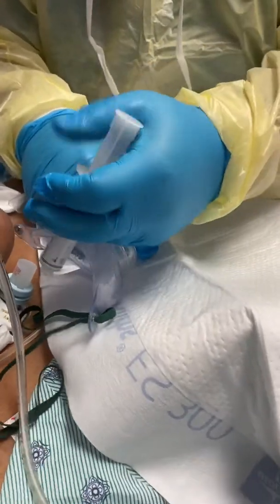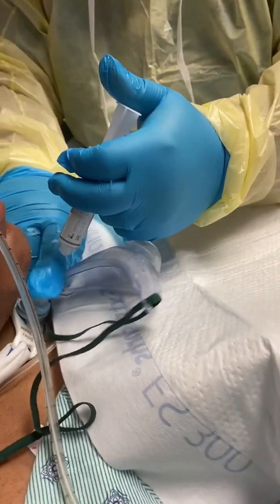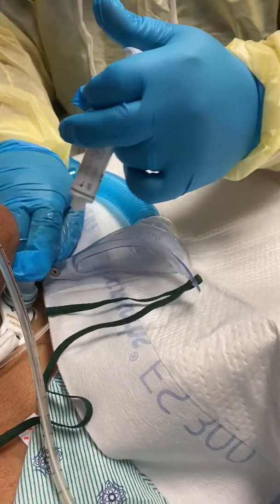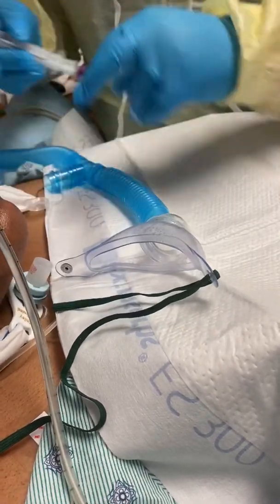Putting a lot of lidocaine in here so it's going to help you — it's going to numb it up a little bit so that way you don't feel it, or you feel it less.